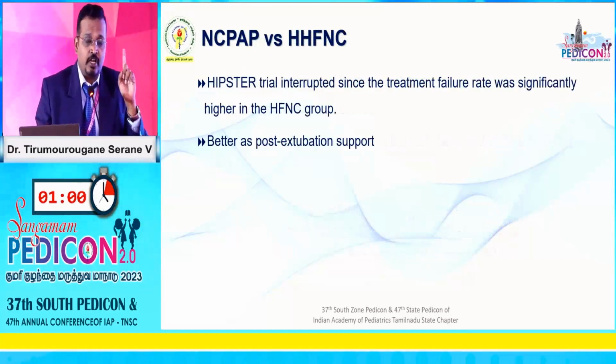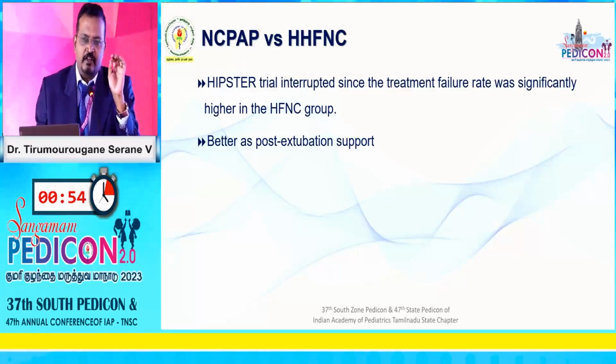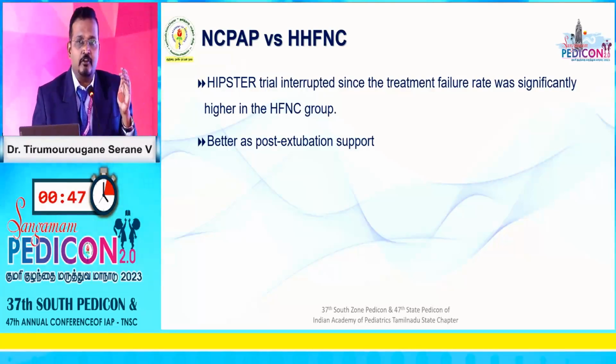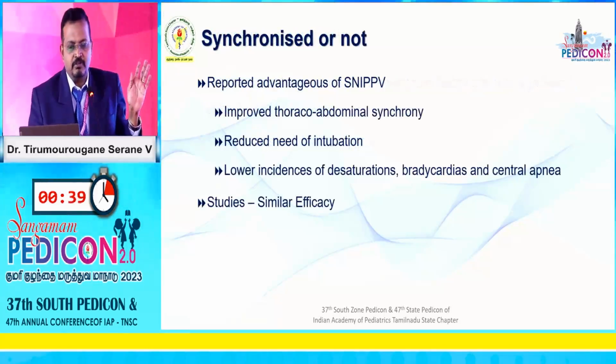But one thing for sure, and this is something I want you to take home: heated high flow as a primary mode of respiratory management is not a very good mode at all. In fact, as you could see in the HIPSTER trial, they had to discontinue the trial because too many babies were becoming sick and even dying. So it could be used as post-extubation support but not as a primary mode.